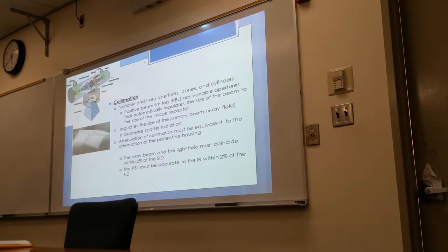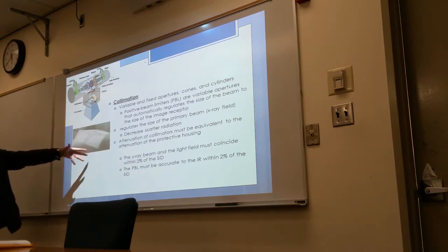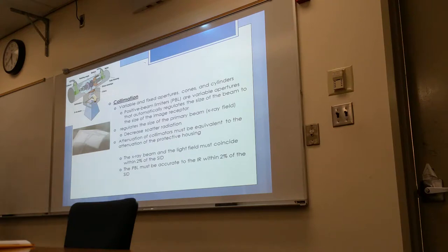Just highlight it. Now the X-ray beam and the light, remember, the light represents the X-ray field. The X-ray beam and the light must coincide within 2% of the SID.